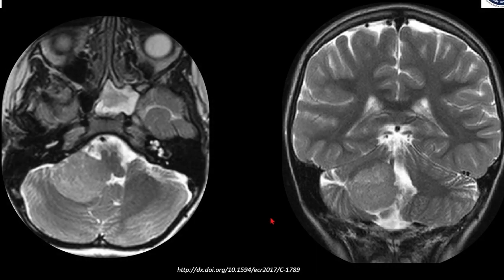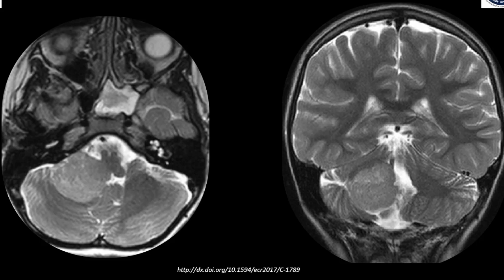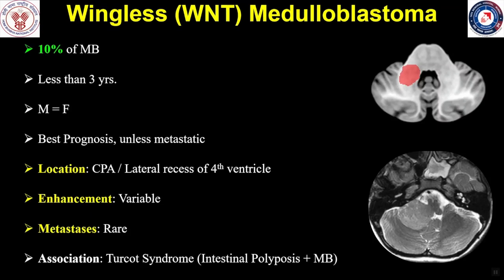This is a child who on MRI scan of the brain, axial T2 and coronal T2-weighted images had a mass involving the lateral recess of the fourth ventricle extending to the cerebellopontine angle, which is iso-intense to the grey matter. This is a classic location for the wingless subgroup of medulloblastoma, so-called because of the WNT gene involved in its pathogenesis.